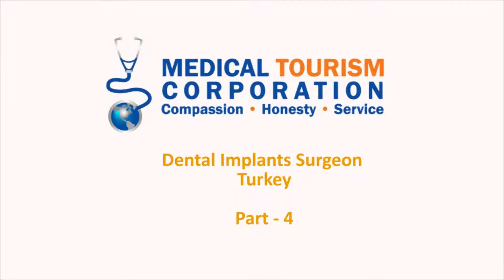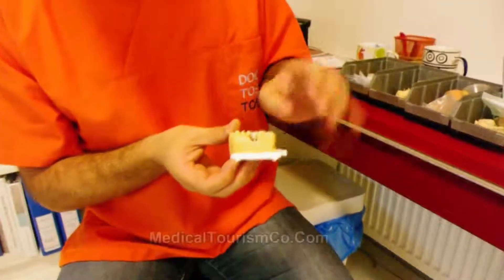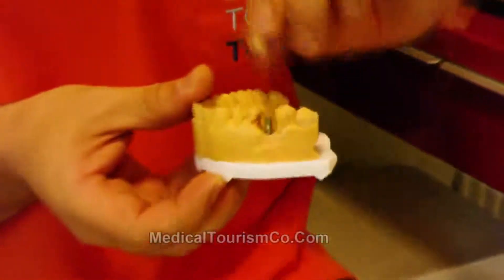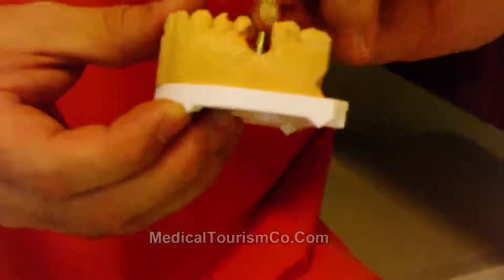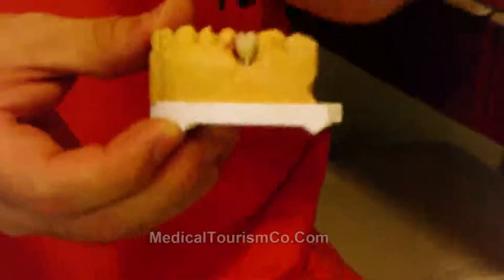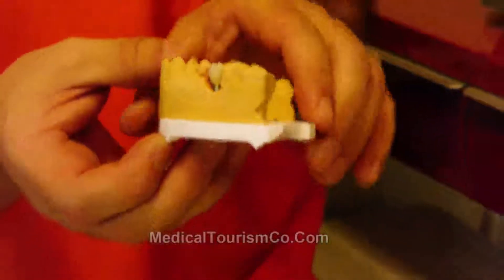This is a four-part video series. We may also do single crowns on top of implants. This is an implant abutment and zirconium work is made on a single implant.